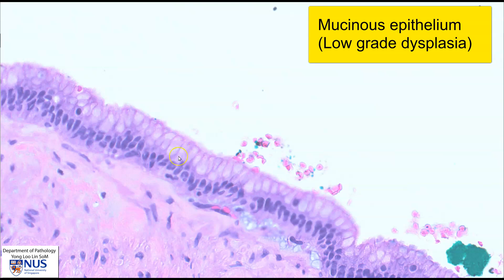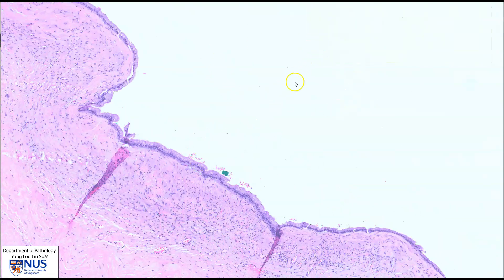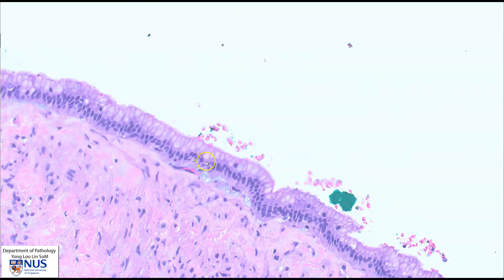The columnar cells have abundant cytoplasm with pale pinkish to sometimes bluish or grayish mucin within the cytoplasm. In many instances these cells produce mucin, so usually in the intact specimen there is abundant mucin filling up the locules, but this drops out during the cutting up of the specimen. So this area shows mucinous epithelium which is low-grade because the nuclei are small, uniform, and polarized to the basal aspect of the cell.